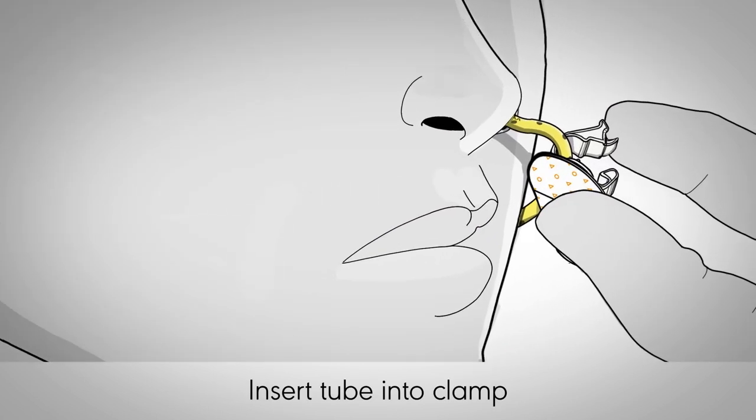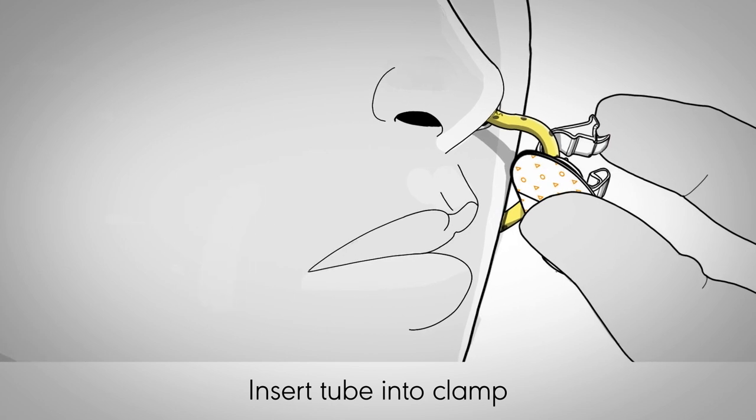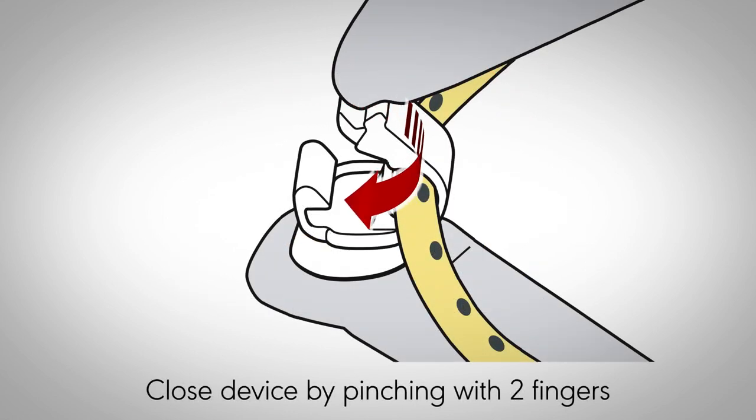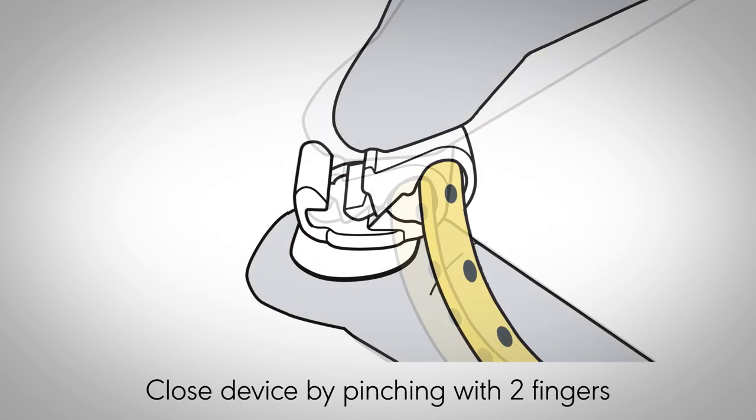Insert the tube into the clamp at the placement site, starting closest to the nare. Ensure the tube is seated in the back of the device. With the tube in place, close the device by pinching the clamp with two fingers.